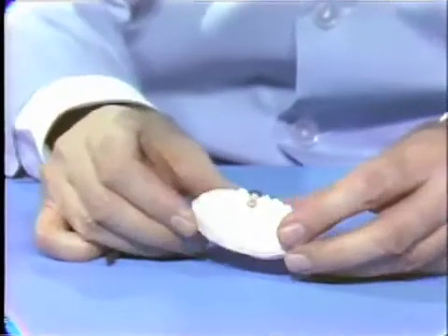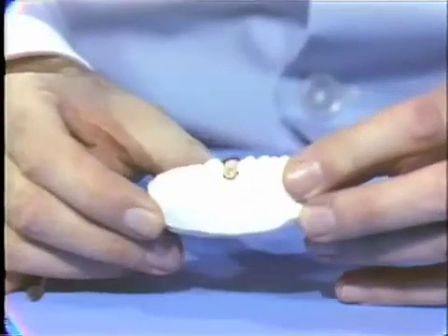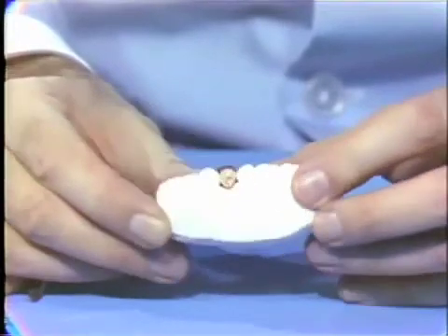Now let's take a look at that and see what we can see there. I think you can see now that the relationship there is about the same on the mesial and the distal. There we are. Let's get it in the middle of the spot. There we are. I think you can see both mesial and distal. Just a couple of little bumps down there towards the mucosa, which I'll round off in the final polishing and finishing of this situation.